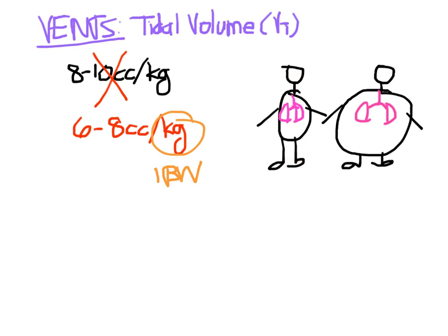I'd look around the room and I'd say, who around here is 5'10"? Oh, that guy is. What does he weigh? He probably weighs about 70 kilos. And I'd go with that. Just an estimate. Unless you like doing that calculation, then go ahead and knock yourself out.